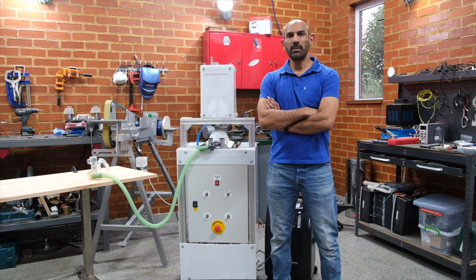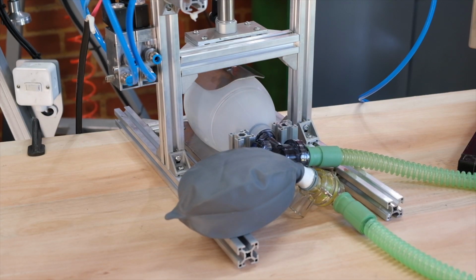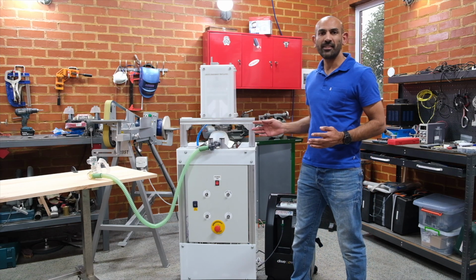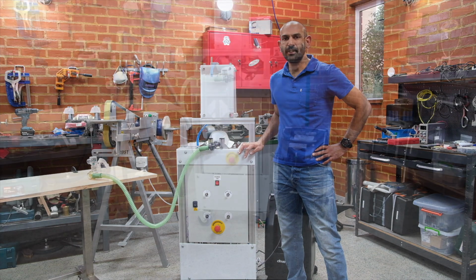I thought I'd give you an update on my Ubuntu emergency ventilator build. So in my last video, I introduced the concept and my first working prototype. As a recap, it's a BVM-based ventilator designed for non-invasive positive pressure ventilation. So as you can see, it's been a busy 2 weeks, and I've taken that initial design and redesigned it for manufacture. So let me now take you through some of the changes.